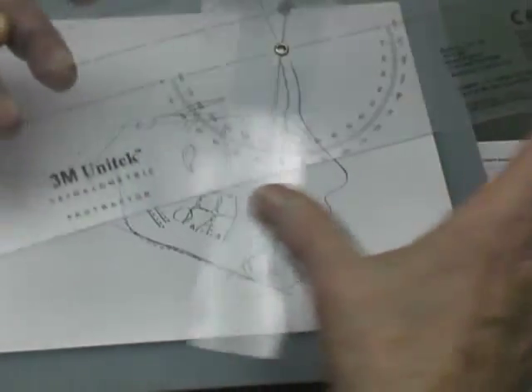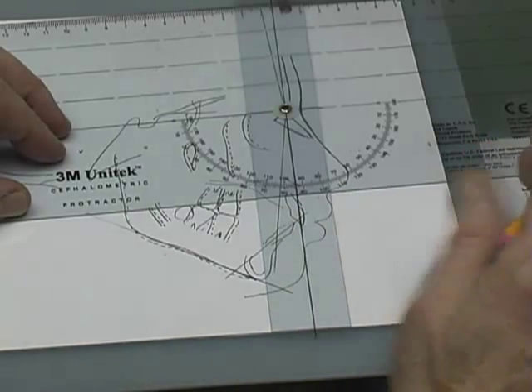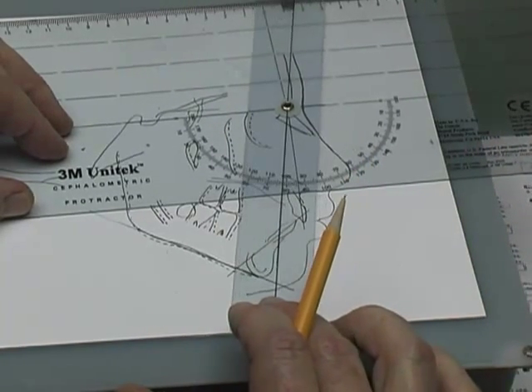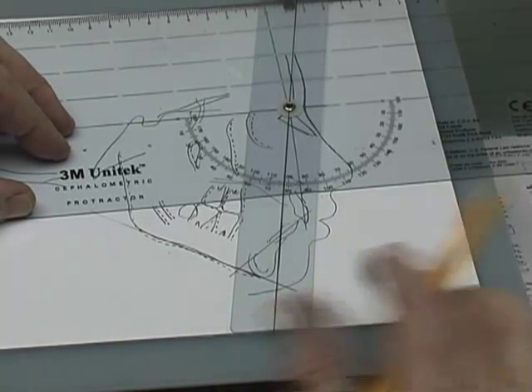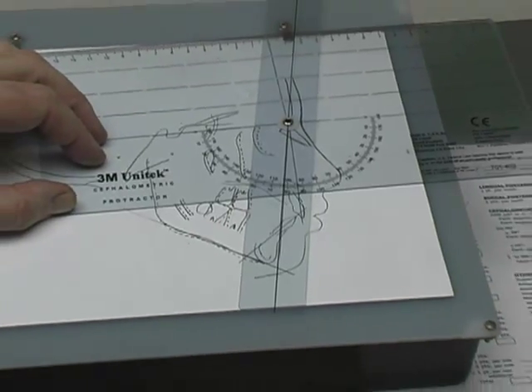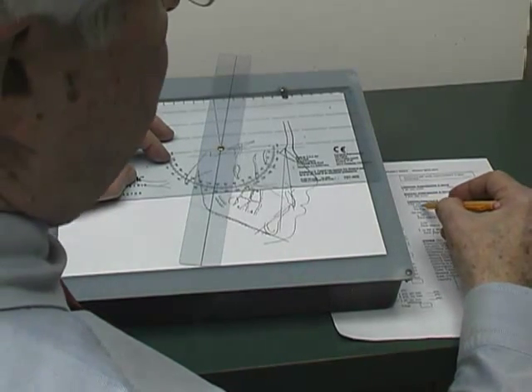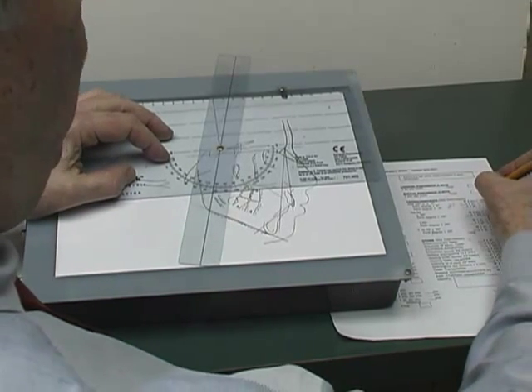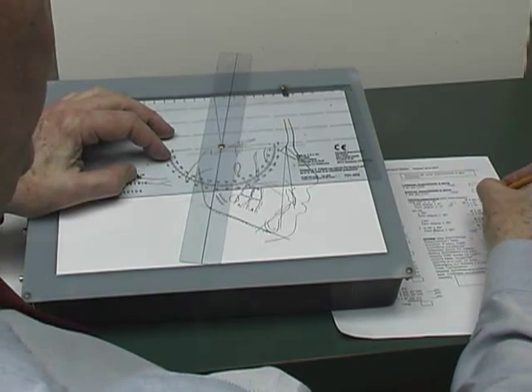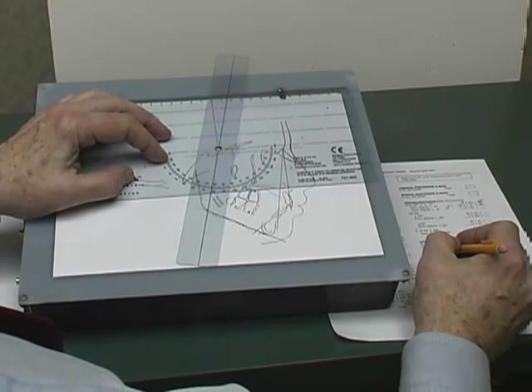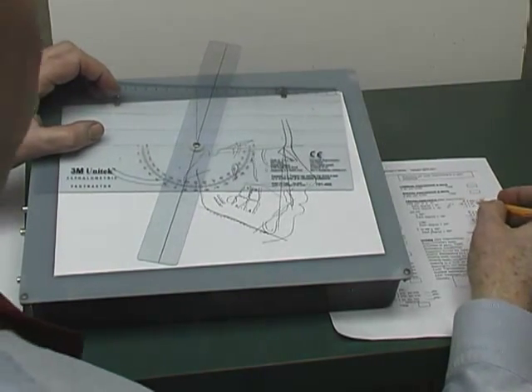Using the cephalometric protractor, SNA comes up with 86 degrees and SNB is 78 degrees. Subtracting gives eight degrees. Up to six degrees scores four points, and the remaining two degrees scores one point each, for two more points — totaling six points for the A and B angle.